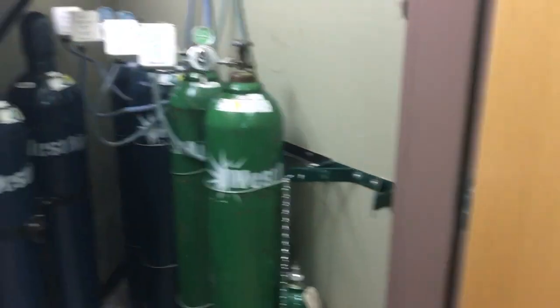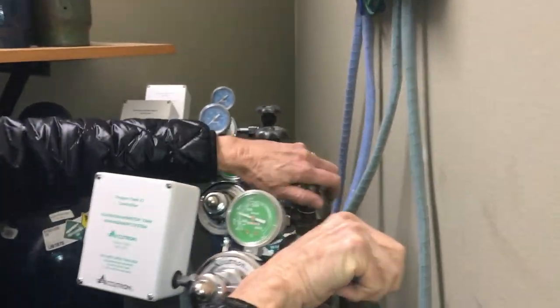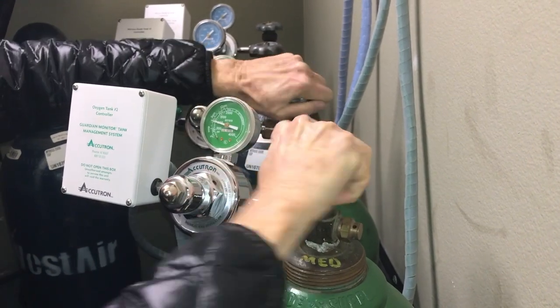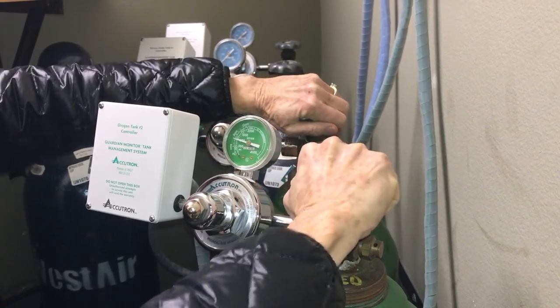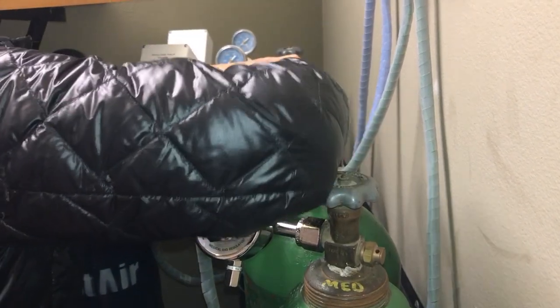Each one of these tanks has to be opened fully for the system to work safely. When faculty are opening these, they will rotate them fully to the left and then turn them back a quarter rotation. Significant resistance is found when opening these knobs, so please confirm they are fully opened.